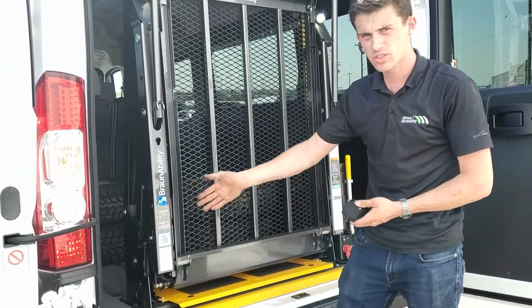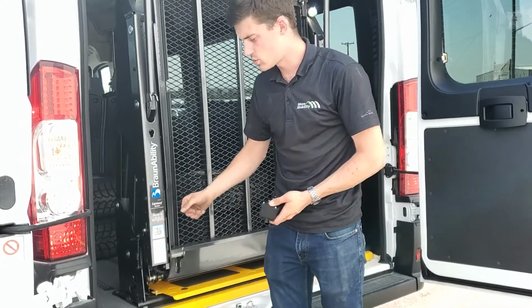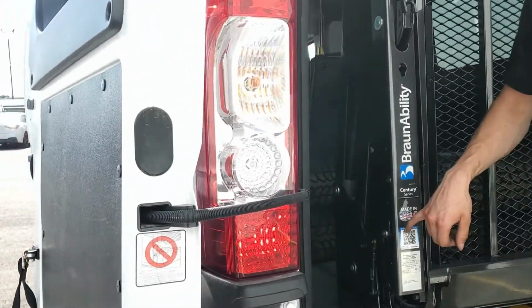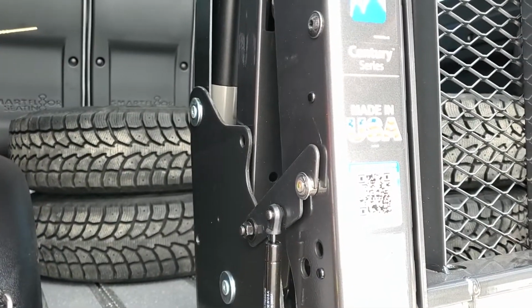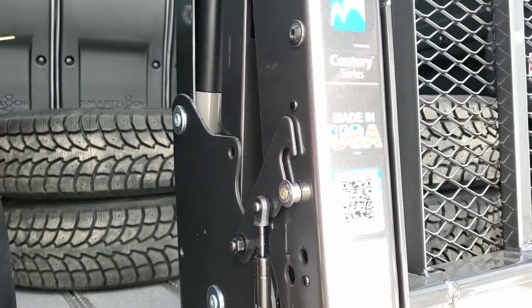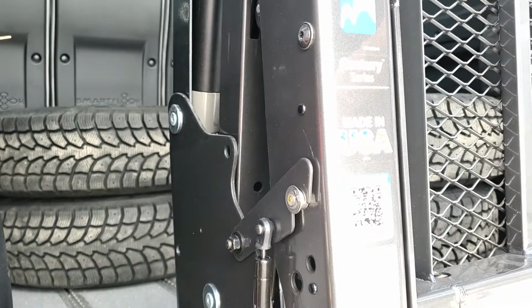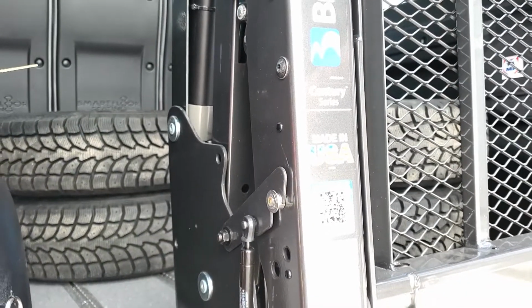So here you can see I've brought the lift out a little, and we've now made the lift catch on the hook here. And while the camera is still here, I'm just going to fold the lift in. As you can see, it is now released, and I will just catch it again. Some clients believe that we should be transporting the lift with the hooks in this position.